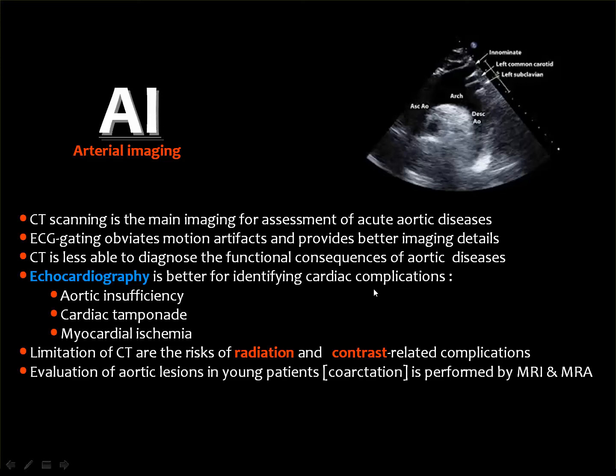Echocardiography has many advantages, actually, being non-invasive and using no ionizing radiation, no contrast material. It is helpful in assessment of the aortic insufficiency, in the accumulation of fluids in the pericardium causing cardiac tamponade, and also in assessment of the myocardial ischemia.